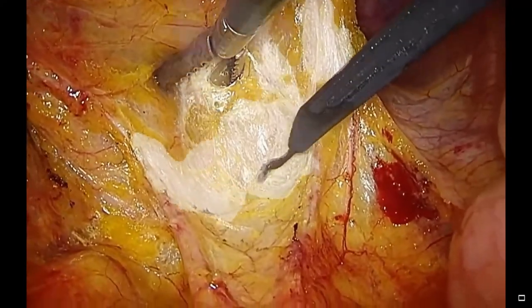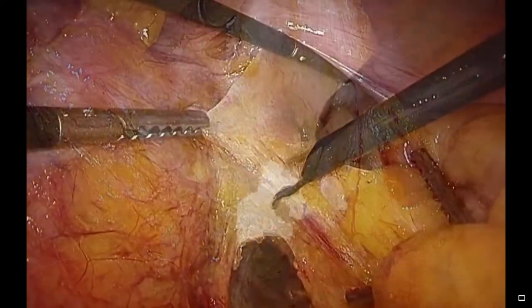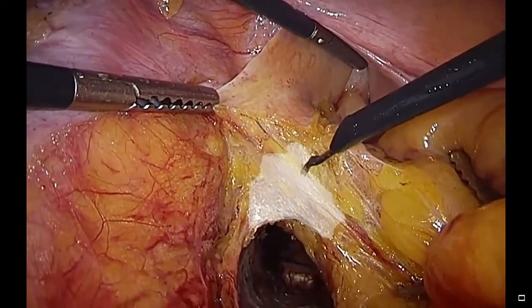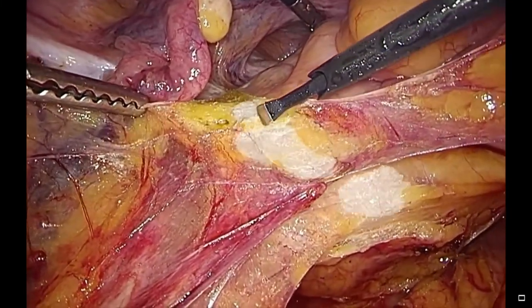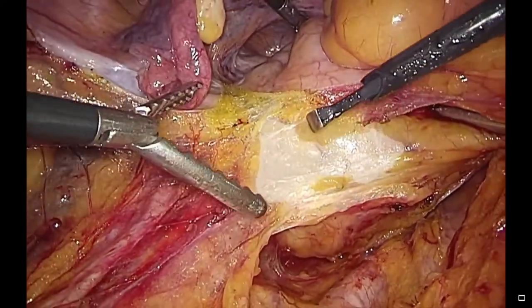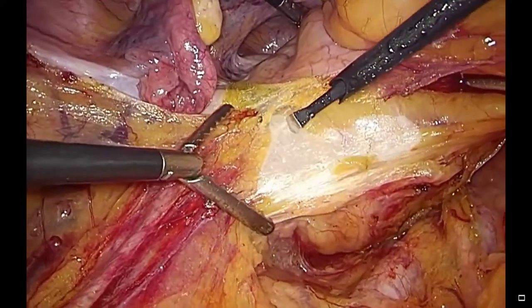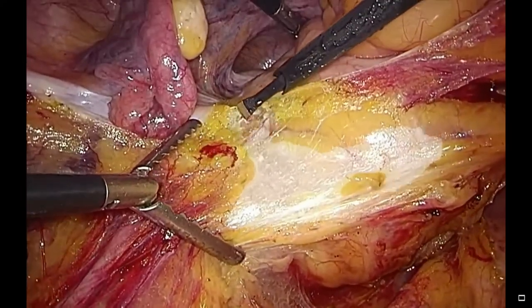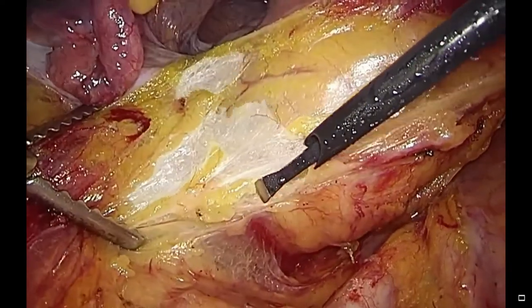This is the first effort toward the realization of a deep learning model of areolar tissue identification for TME. There are various possibilities in our system, including evaluation of surgical quality, skill assessment, and the automation of surgical robots.